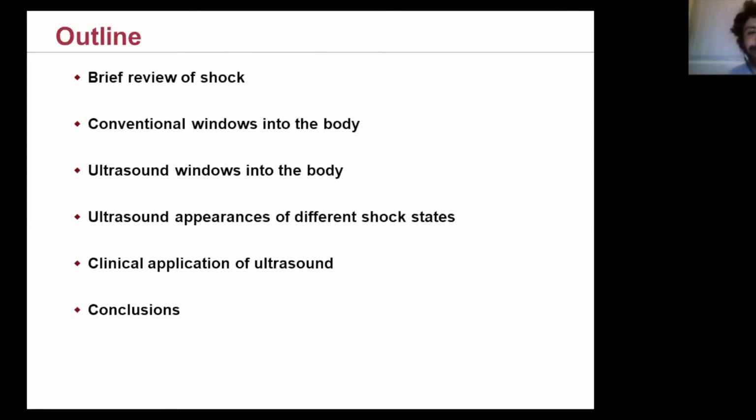their patients. The way I wanted to talk about this, I'll describe shock briefly because I know that you're all very aware of the mechanisms. And then I'll talk about the conventional ways that we assess a patient in shock. And then I'll talk about the ways that an ultrasound can offer an alternative method for assessing a patient in shock. I'll describe some of the ultrasound appearances of different shock states, and then bring it back to talk about some of the clinical applications for managing a patient in shock.